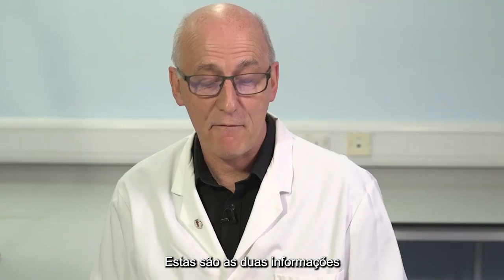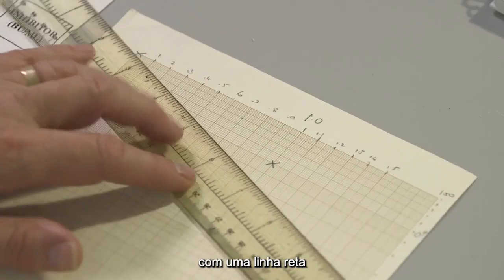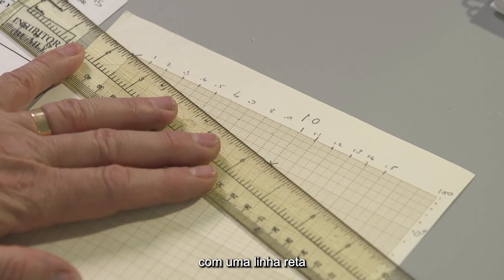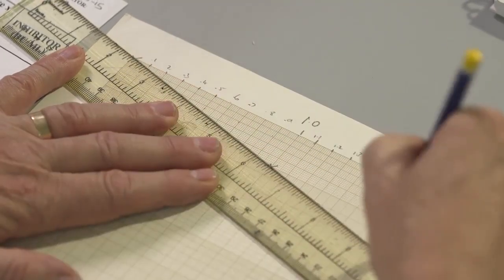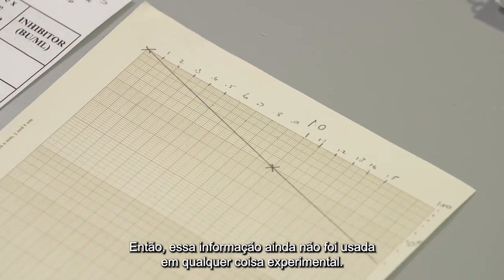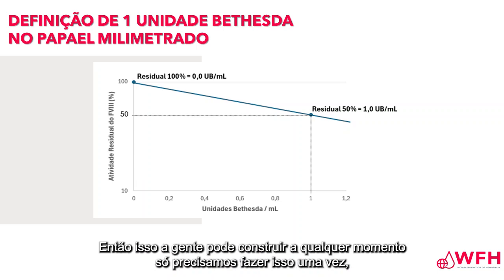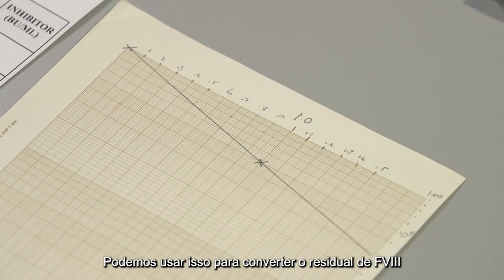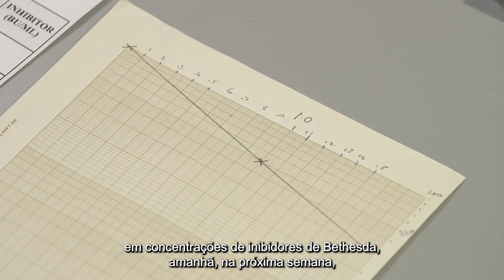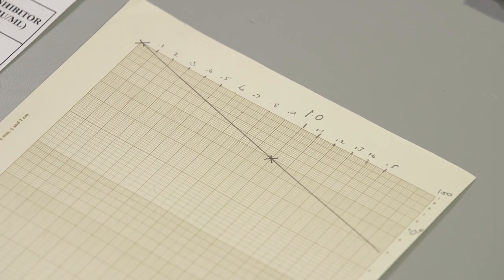These are the two pieces of information. And we use that with a straight line in this way. So this piece of information has not yet used anything experimental. This is simply from the definitions. So this we can construct anytime. We only need to do this once. We can use this to convert residual factor VIII into Bethesda inhibitor concentrations tomorrow, next week, and that's fine.